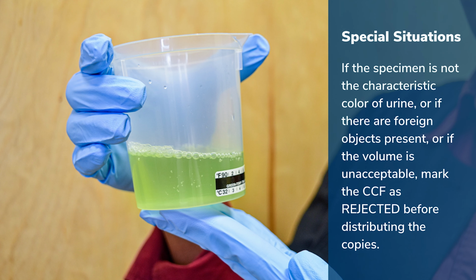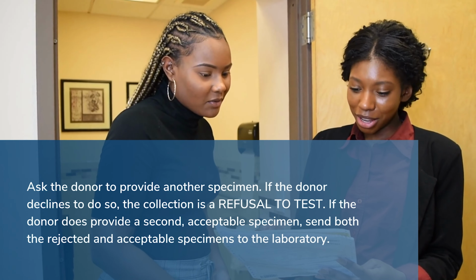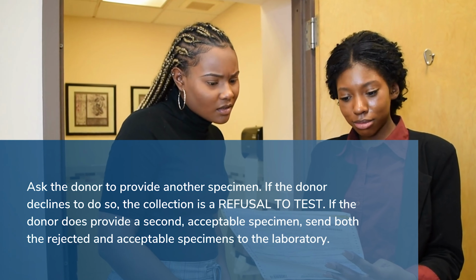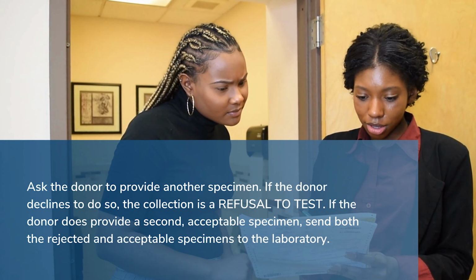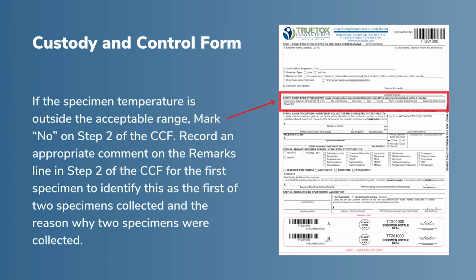Special situations. If the specimen is not the characteristic color of urine, or if there are foreign objects present, or if the volume is unacceptable, mark the CCF as rejected before distributing the copies. Ask the donor to provide another specimen. If the donor declines to do so, the collection is a refusal to test. If the donor does provide a second acceptable specimen, send both the rejected and acceptable specimens to the laboratory.